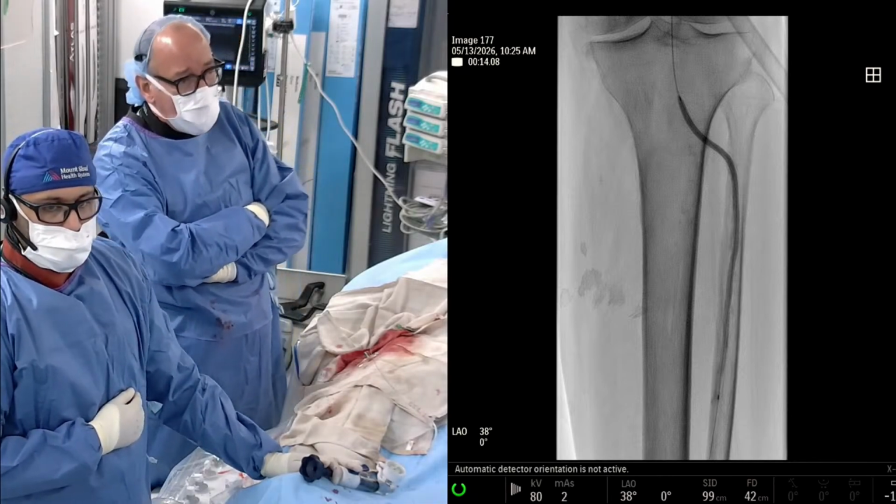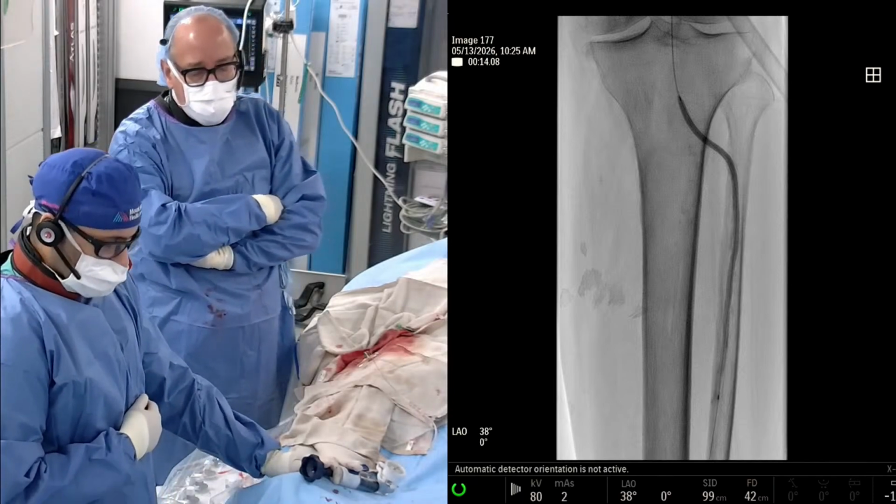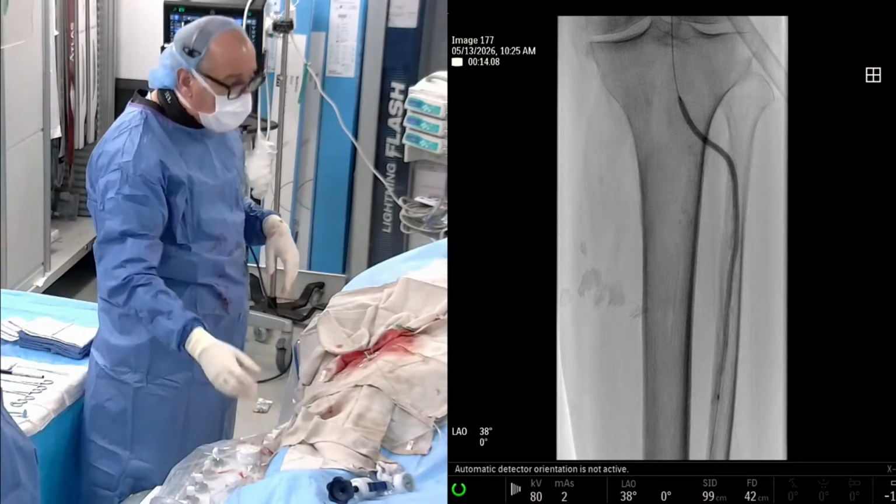But we want to make sure that we've got good luminal gain here. We'll show you what that looks like in just a minute, obviously. But Raj, if you want to get that prepped up, that would be great. So we're not wasting time.